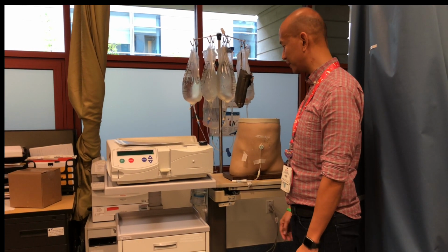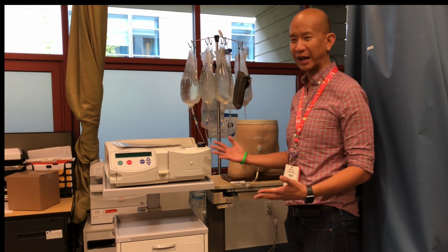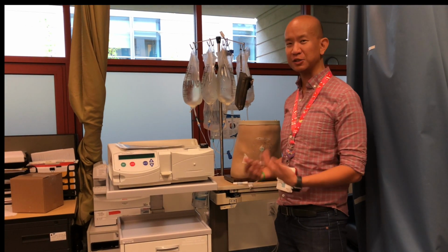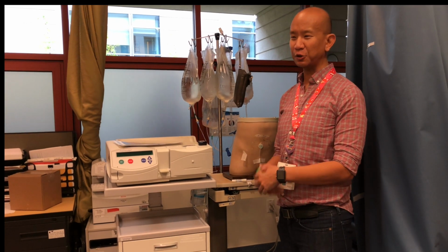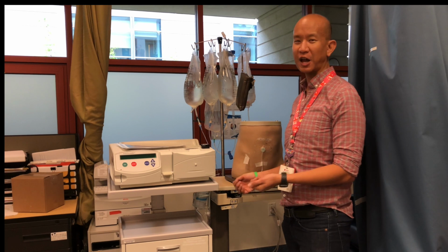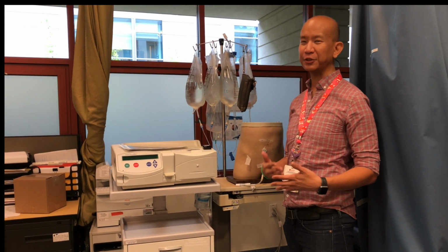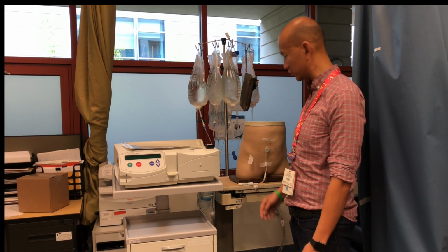After that has been calibrated and the tubing system has been primed with the dialysis solution, the patient will then be connected directly to the dialysis machine. This is a sterile process, so it has to be performed with sterile technique to make sure to not introduce any bacteria into the catheter, which would increase the risk for developing peritonitis for the patient.